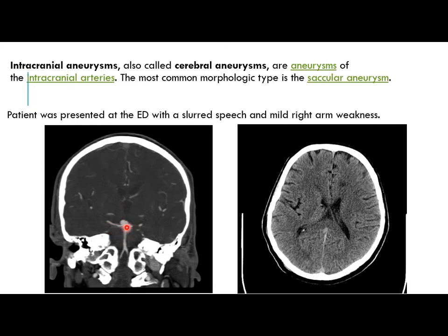As we did this imaging, we find that there is an aneurysm at the end of the basilar artery in the circle of Willis. This may be the cause for the findings with which the patient presented to the emergency department. Actually, in the other image we can also see hypodense areas in the frontal lobes, due to the effect of the aneurysm. In the left frontal lobe we can see it.